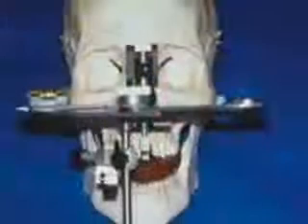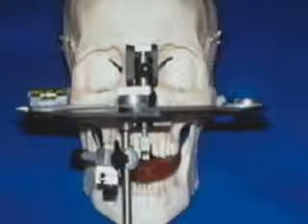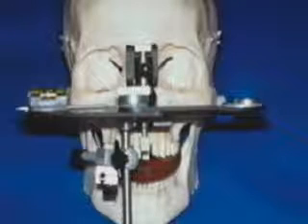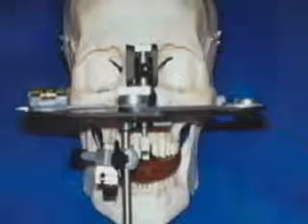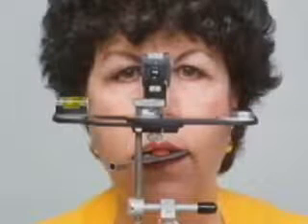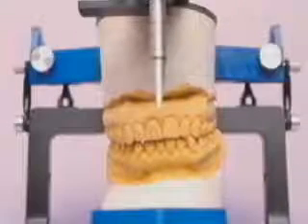There are greater concerns, however, when the occlusal vertical dimension needs to be altered. In addition, the aesthetic information — i.e., the maxillary occlusal plane — may be transferred improperly if the patient's ears are uneven or the third point of reference is inappropriate.